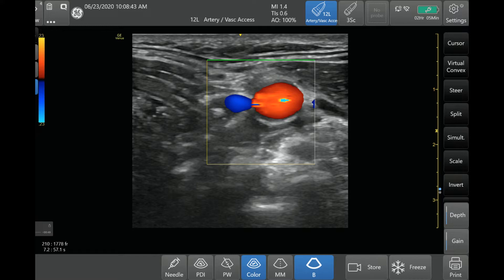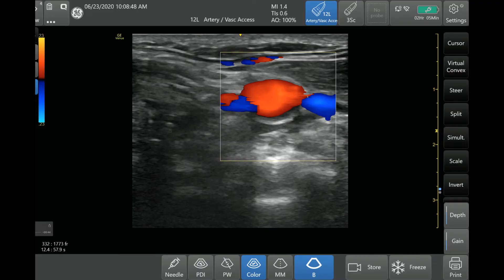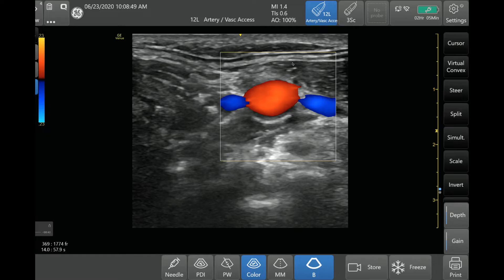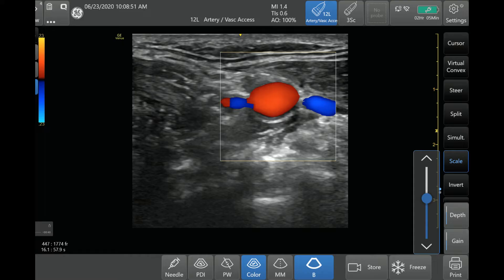Now I have it over the carotid artery and I'm adjusting. Another thing you can do is adjust the size of the box as well as move it. So that's what I'm doing right here, just adjusting the size of the box.